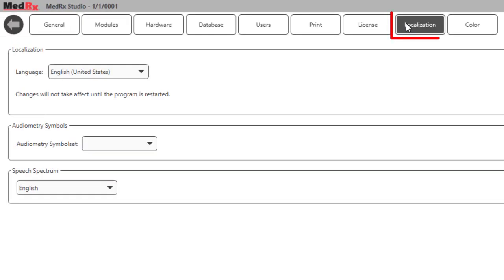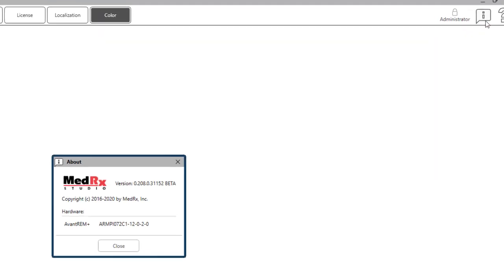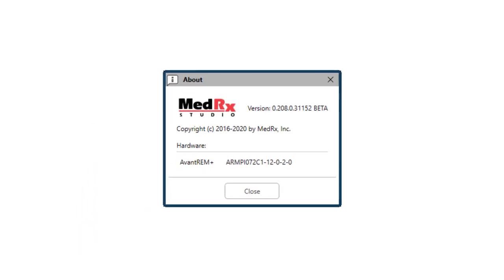The Localization tab allows for default settings to be changed when the language or symbols used as default need to be changed to reflect the country or standards. The Color tab allows you to set the color of the module and screens to your preference. The Info icon will allow you to find and view the current software version, serial number, and see available updates and downloads.